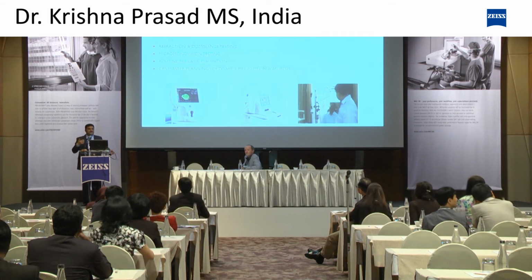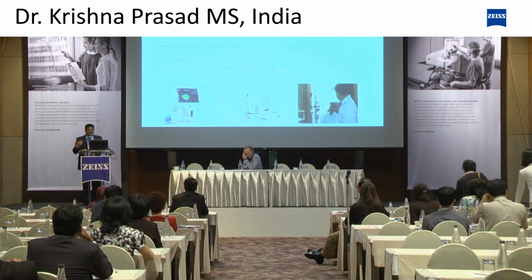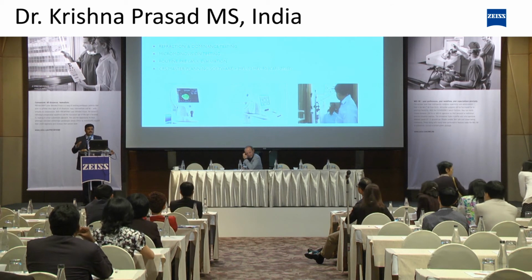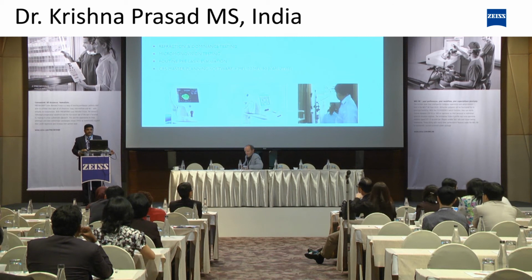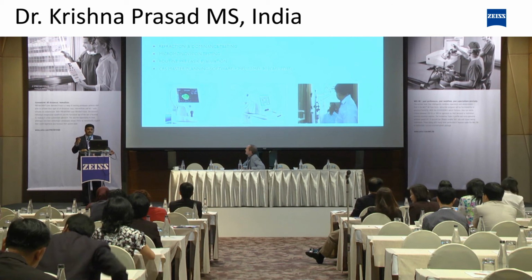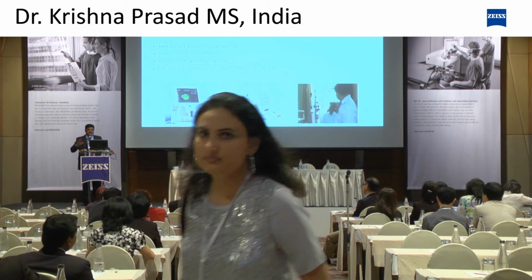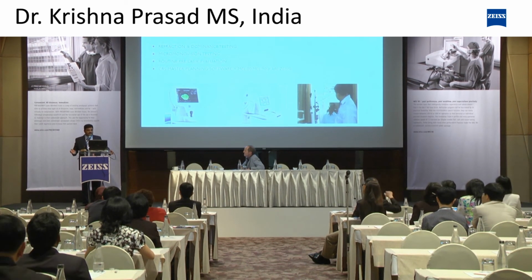That's why, being an ophthalmologist, especially for patients who are very interested in this treatment, I check the dominant eye, followed by micromonovision testing. Then we need to explain to the patient that this is the vision you are going to get after the treatment, so you need not compare each of the eyes, or close one eye from the other.